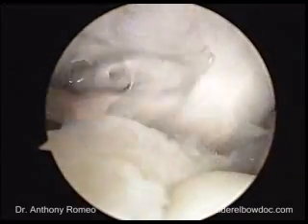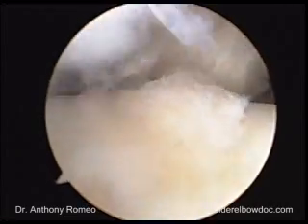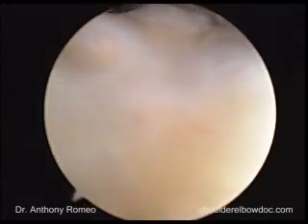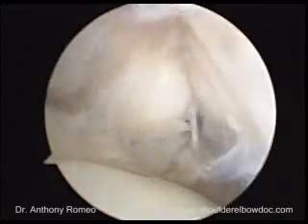There is a hole in the rotator cuff that we see here, consistent with a full thickness rotator cuff tear. It involves the entire supraspinatus as it's coming around the backside, but maybe just the leading edge of the infraspinatus. We'll get a better appreciation of that in the subacromial space.